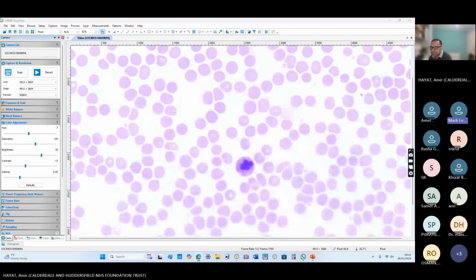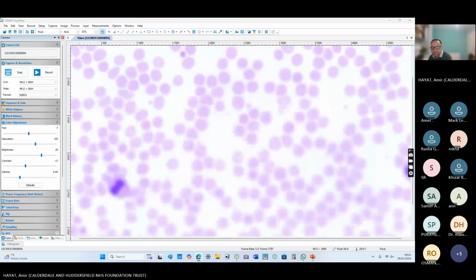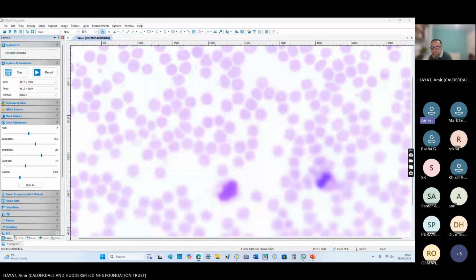Oh, right, sorry. Clinical. This is a 2-mark question in the exam.